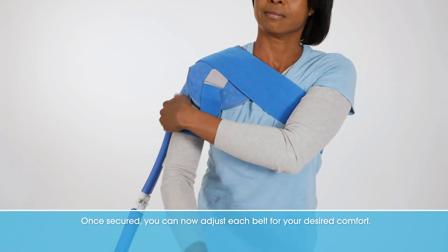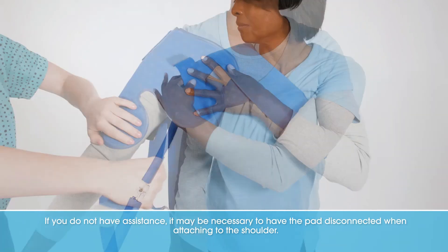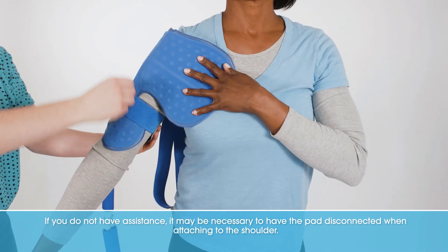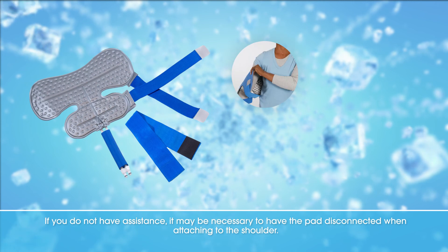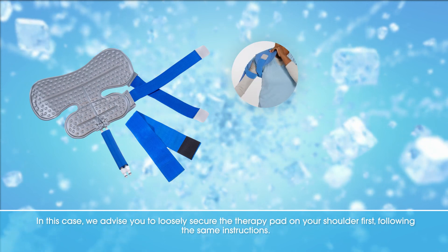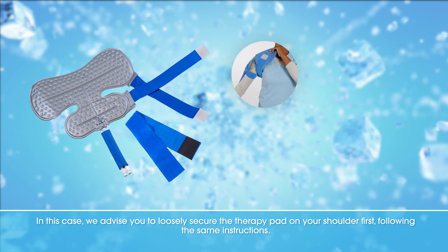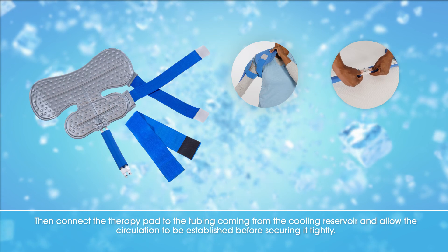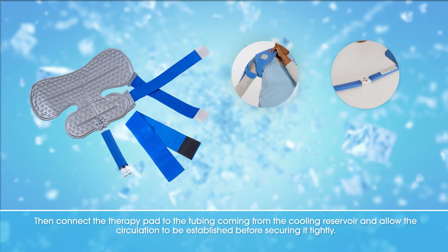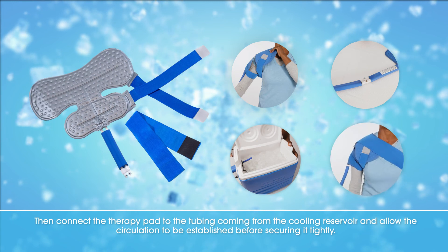Once secured, you can now adjust each belt for your desired comfort. If you do not have assistance, it may be necessary to have the pad disconnected when attaching to the shoulder. In this case, we advise you to loosely secure the therapy pad on your shoulder first, following the same instructions. Then connect the therapy pad to the tubing coming from the cooling reservoir and allow the circulation to be established before securing it tightly.